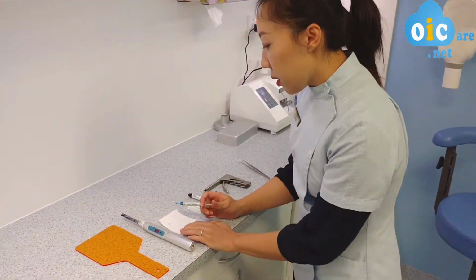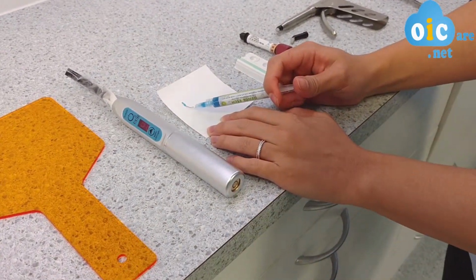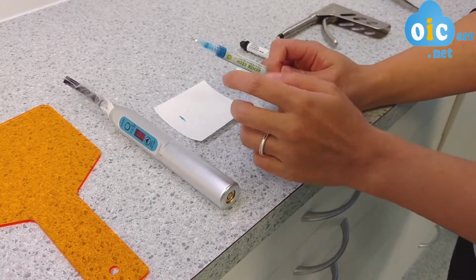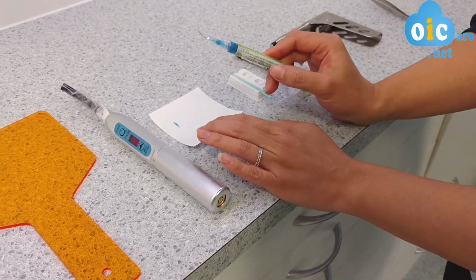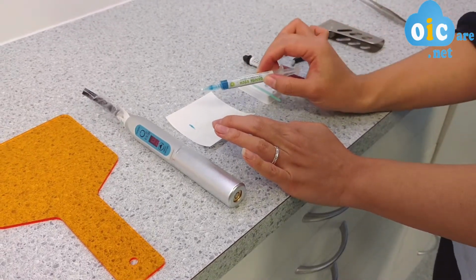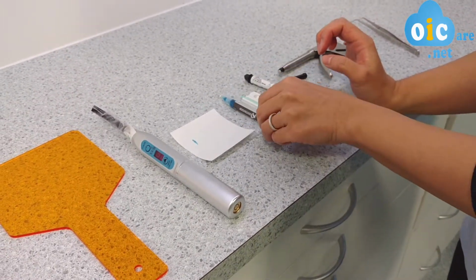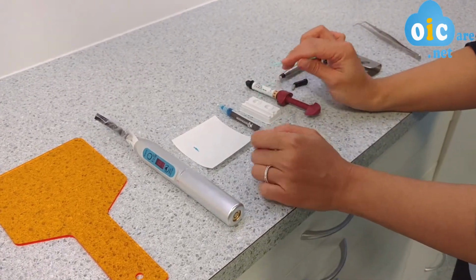It comes out of the syringe like this, just like a blue gel. This is just a delivery system. We don't poke this into your tooth or anything like that. It just looks a little bit dangerous, but it's not at all. We leave this on the surface of the enamel for about 20 seconds, and we wash it away with water. After that is done, we apply a very flowable type of resin glue.